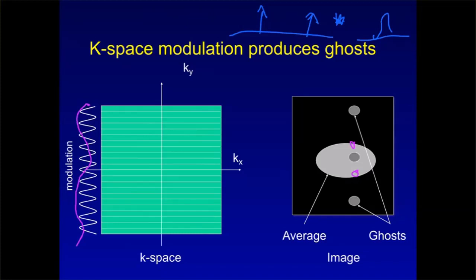I have a question as well. We were mentioning that the vessel itself in the previous slide gets darker and brighter. Does that happen because the spins are physically moving along the blood vessel? Yeah, that's right. The slice itself is being knocked all the time, so it reaches a certain steady state, which is the magnetization. It's much lower than M0 because it depends on T1. So when new spins come into the slice because of the flow, they have not seen the RF, they have not been saturated. It's just full magnetization. And now they've been knocked down, so that is then they'll become brighter. Now it's a pulsatile flow, so the blood kind of halts and it's being knocked down. And then again, new spins come in, it becomes brighter. Does that make sense? Yeah, thank you.